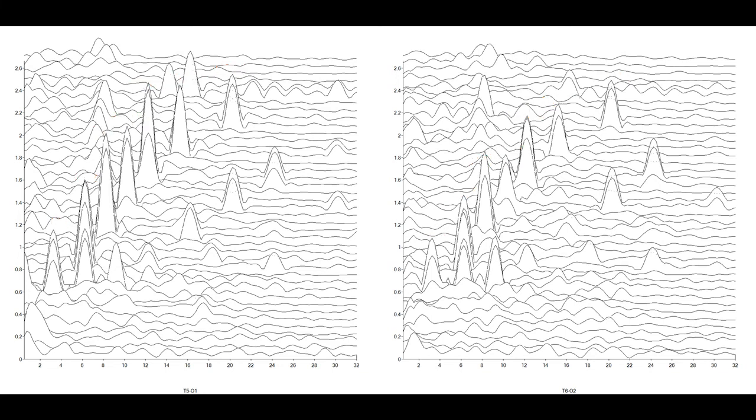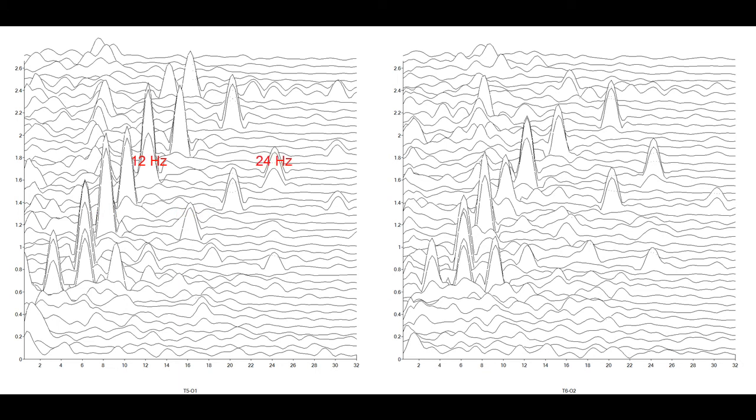Other interesting information is evident in this graphical representation of the EEG spectrum. At several flash frequencies, such as 8, 10, and 12 Hz, clear secondary harmonic peaks are also present.